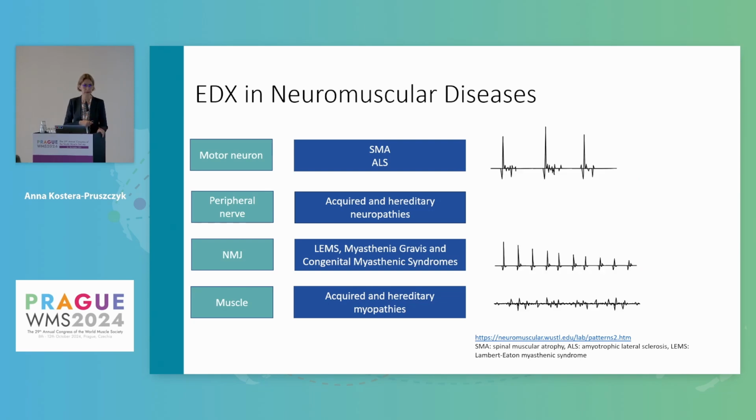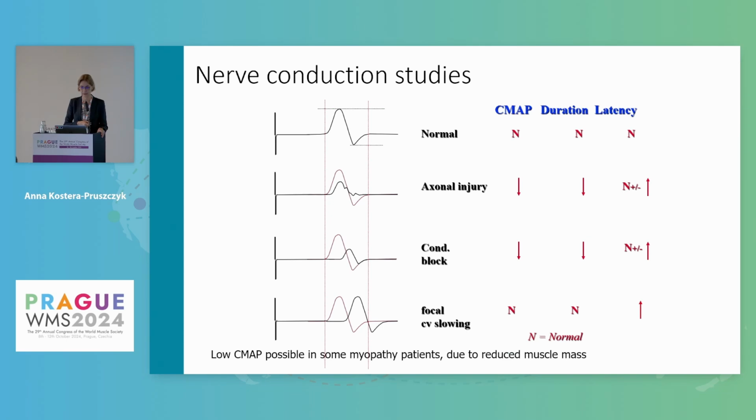What we see during EMG examination, we see different patterns. So again, it is about adding the clinical pattern to the electrophysiological pattern, with reinnervation leading to large motor units. In LEMS and myasthenia we have a decremental response, and myopathy has small polyphasic brief motor units.